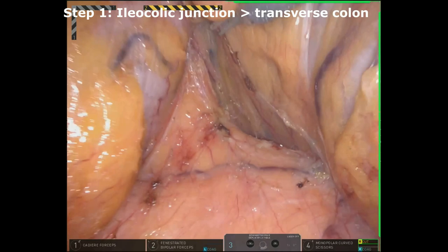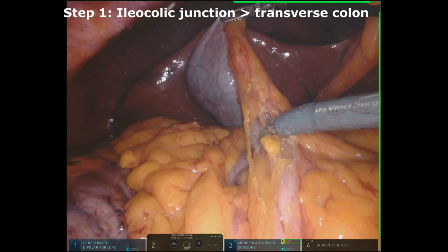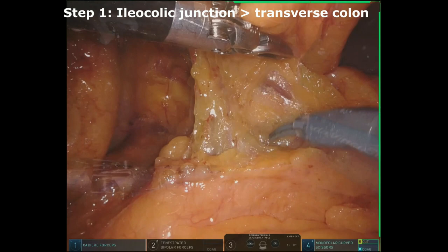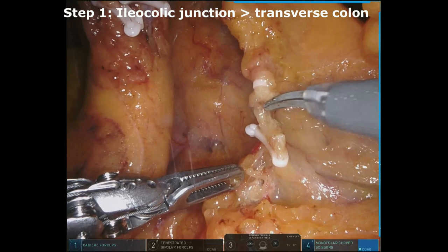The mesocolon was completely detached above the duodenum and the pancreas head. The right mesocolon was entirely detached and the hepatic flexure was mobilized. The gastrocolic ligament was detached from the transverse colon to open the lesser sac. The superior right colic vein was subsequently identified and ligated. Dissection was carried on as far as possible toward the transverse mesocolon, and the middle colic vessels were dissected and transected. In difficult cases, the camera can be replaced through the right paraumbilical port and a two left hands conformation allows better vision on the left part of the transverse colon.